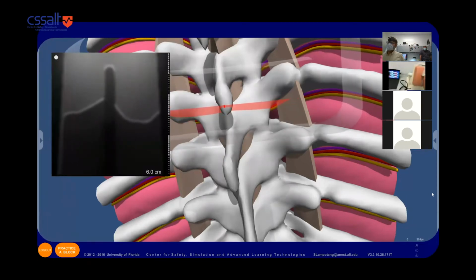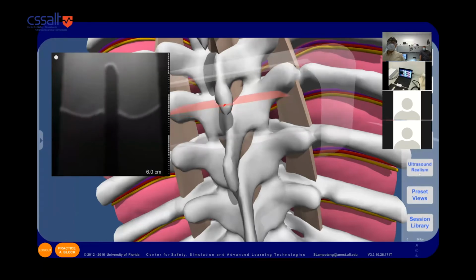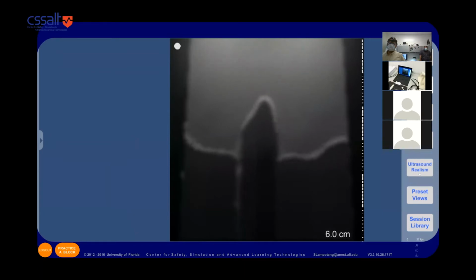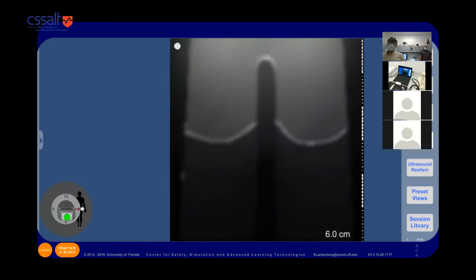And if I wanted to give you, here's a full screen. That's typically what you would see. So what you can see is a spinous process. And now you just fell off one of the other spinous processes. And you can see, yeah, there's the tip of another one. So you can use your ultrasound probe, provided that you are holding the probe perfectly upright.